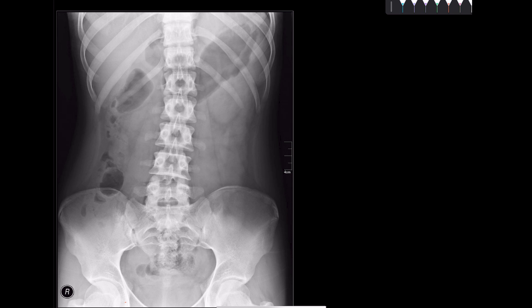The approach to the x-ray abdomen includes: first, we should identify the image — is it an anterior-posterior supine view or a lateral decubitus view? Then we should look for the patient's ID and sex. After that, we should assess technical adequacy — checking whether all essential elements of the body are covered within the given x-ray. We should also look for the presence of any artifacts or foreign bodies.